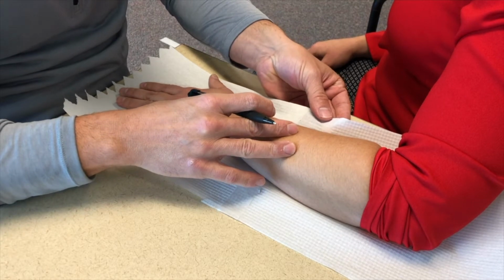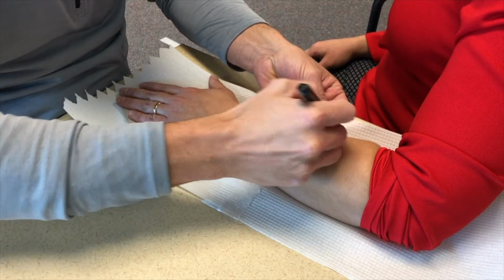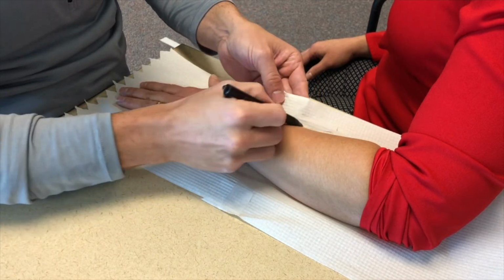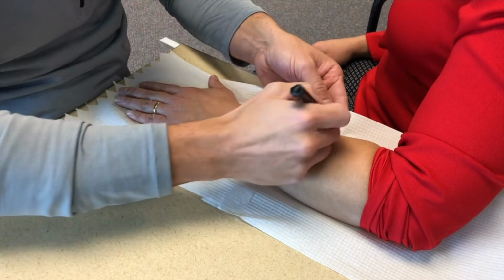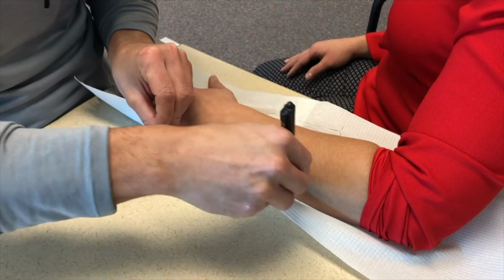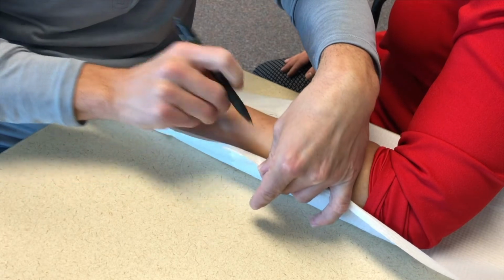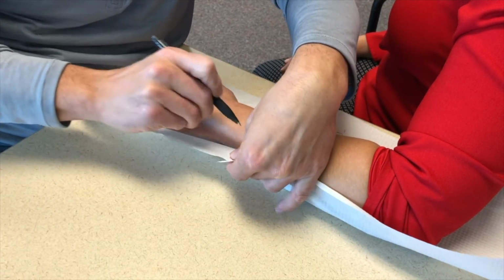You want the trough of the splint to be 2/3 the length of the forearm, as well as 1/2 to 2/3 the width of the forearm. So you're going to draw a pattern of your forearm along your paper towel. You want to be as precise as possible because that will limit the amount of cutting you have to do after you fabricate or during the fabrication process.